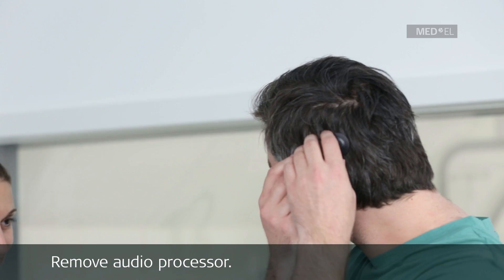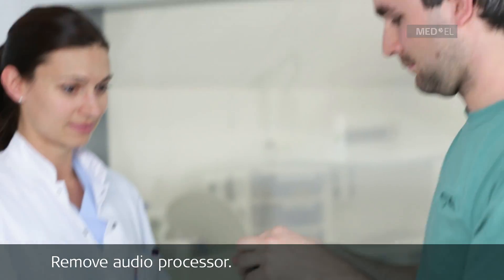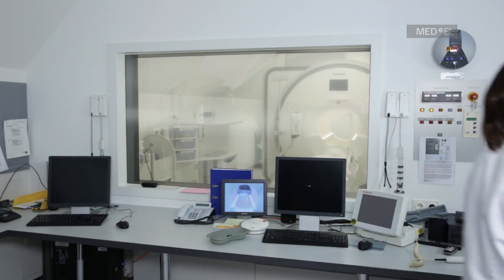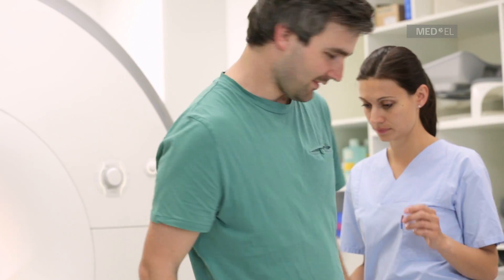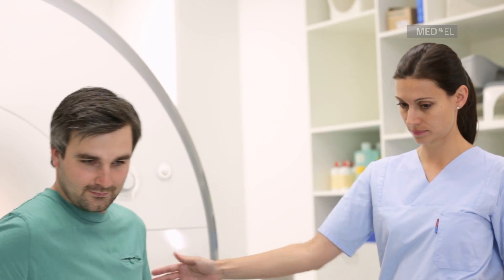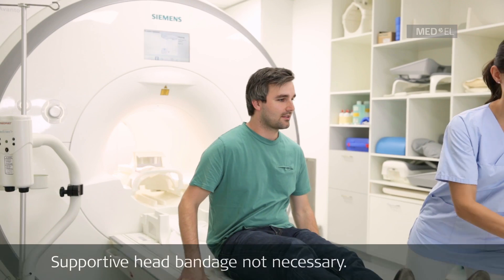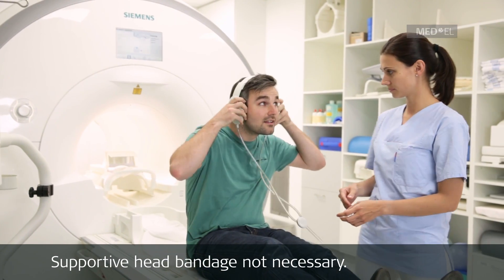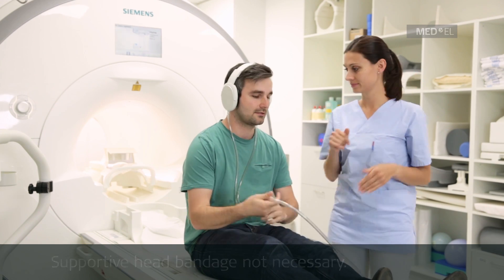Remove the external components of the system, such as the audio processor and any accessories, before entering the scanner room. The patient will likely not be able to hear after removing their audio processor, but will be able to hear immediately after the processor is returned. For patients with synchrony, a supportive head bandage is not necessary at any field strength, as there is minimal magnetic force on the implant.